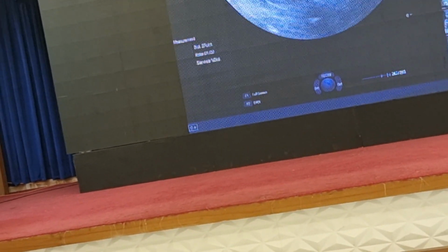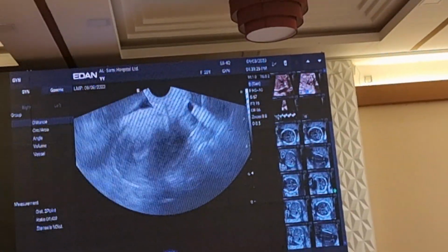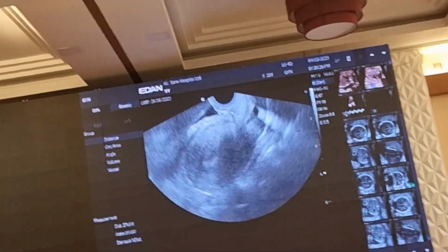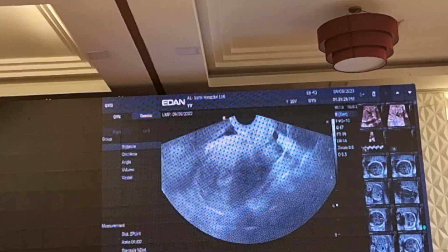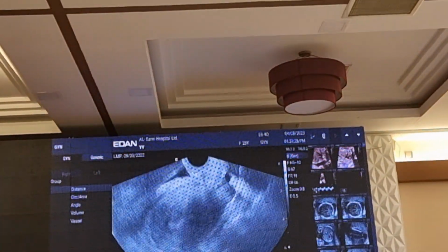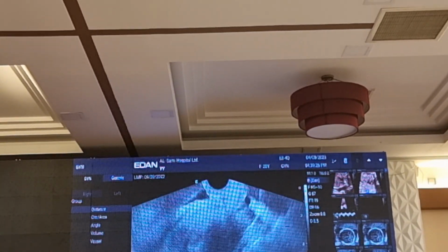She wants to know whether these are those typical Venetian blind appearance of the myometrium. So if you have seen the pictures of the Venetian blind things, you actually see lines going across the myometrium. What we are seeing over here is this one little shadowing, and this is probably coming from one small Nabothian cyst or maybe a vessel or something like that. So when you have the typical Venetian blind appearance, you have it coming from the myometrium completely.